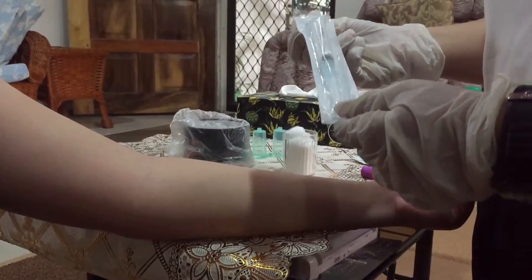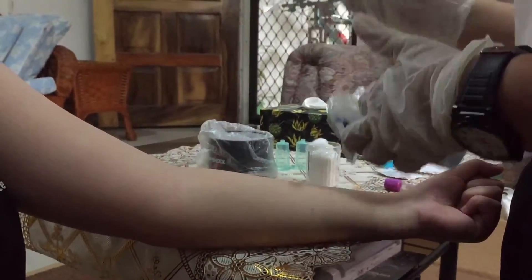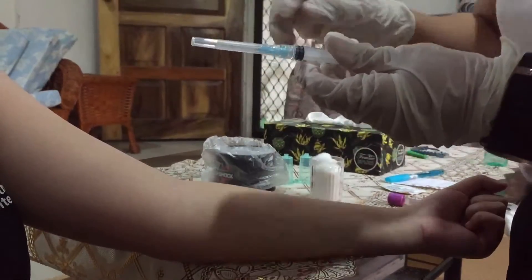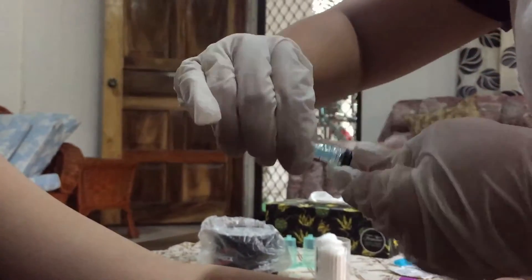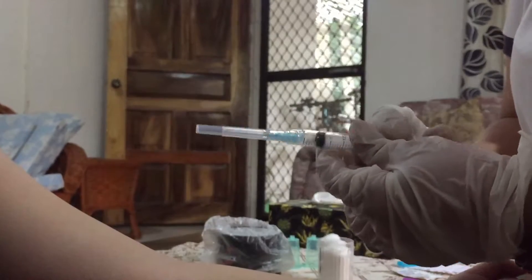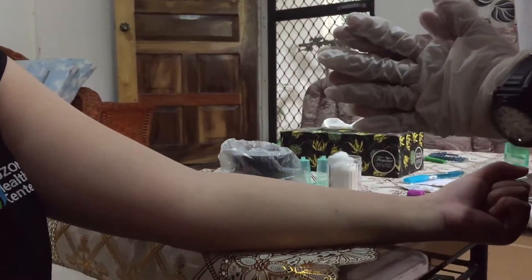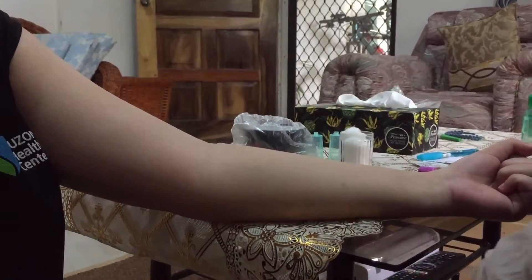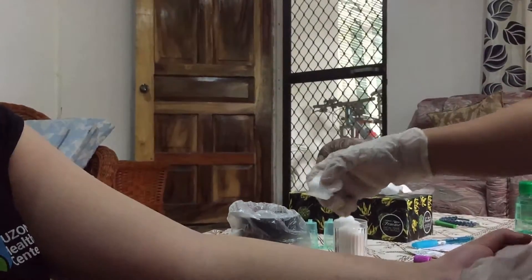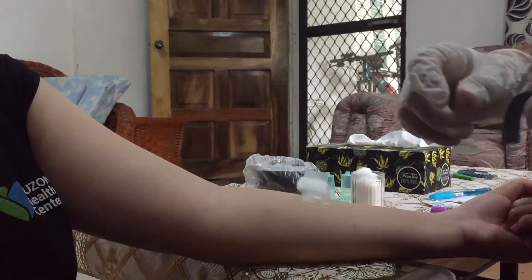Prepare your needle or your syringe. We'll be using the 3cc. As you can see, there is a gap here — don't forget to tighten that. Then release any pressure. Do not blow on the arm; let the site air dry only. While waiting, prepare your tape with cotton.